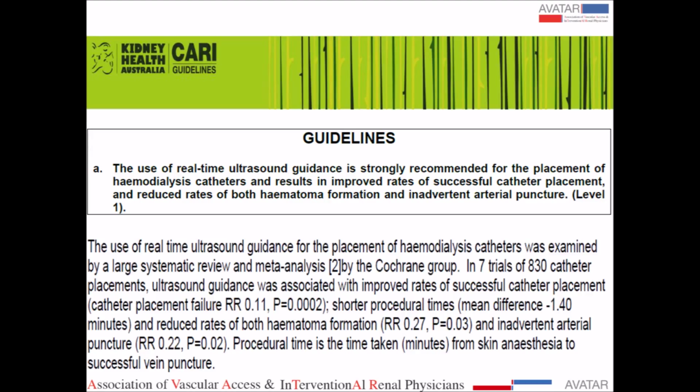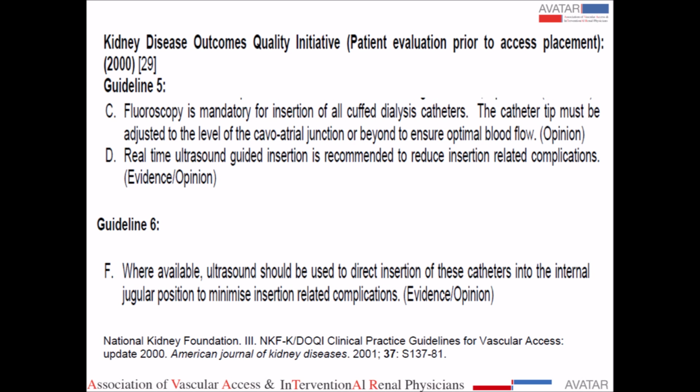And they have also given figures for when we use ultrasound guidance, and I'll be talking about this later also, on what the advantages of ultrasound guided insertion are over and above the landmark insertion technique. If we talk about the KDOQI guideline, then they say that ultrasound guidance is recommended to reduce insertion related complications. That is evidence/opinion based, and it should be used preferably, especially if we are using the internal jugular vein.